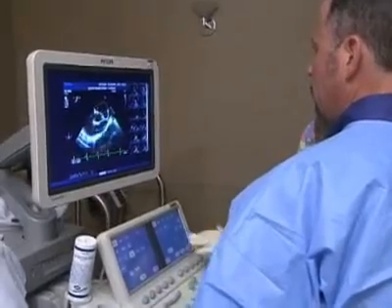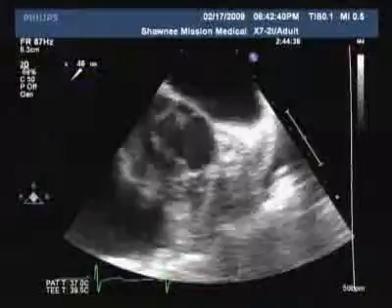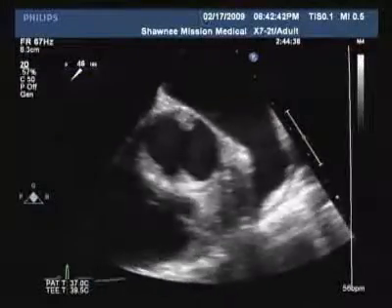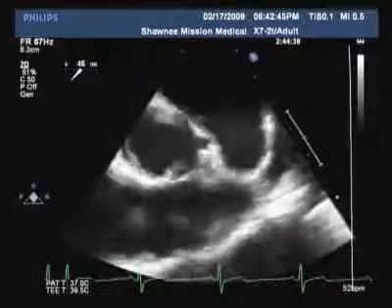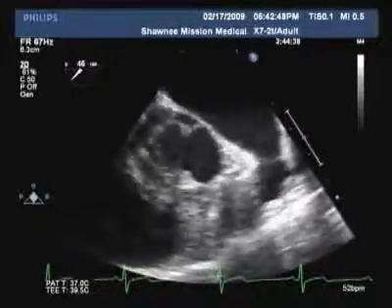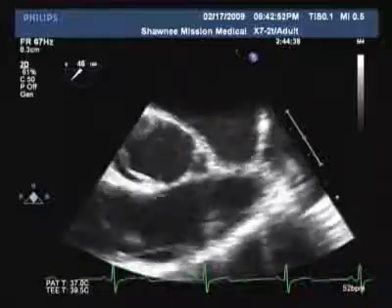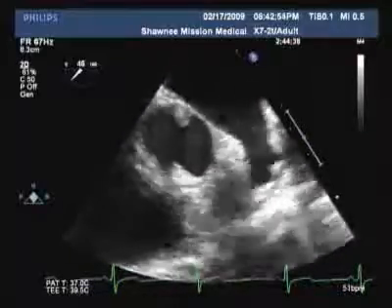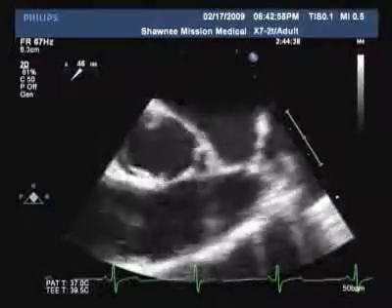Structure, not in this patient since this is perfectly normal, but that's exactly. We use the transesophageal procedure for looking at this structure, don't we? That's exactly right. This structure on the right there is a little bit of a crescent structure, and actually that aortic valve is back there on your left again, and that crescent structure is actually called the left atrial appendage, and you cannot see that structure from a regular echocardiogram from the outside of the body.